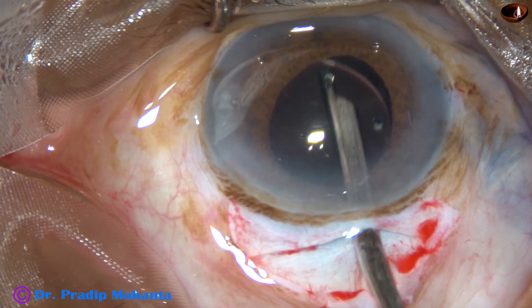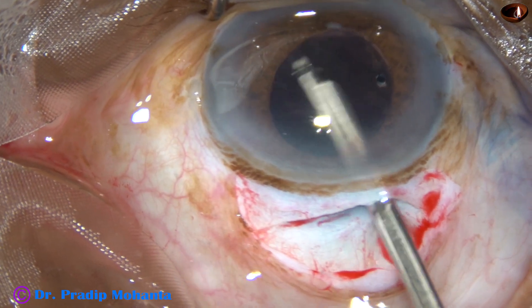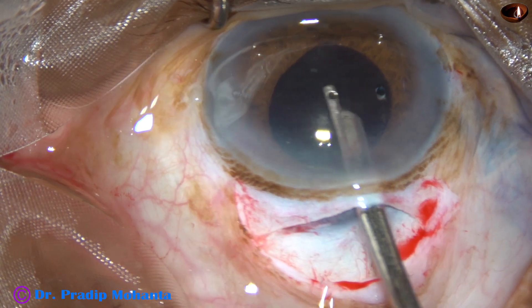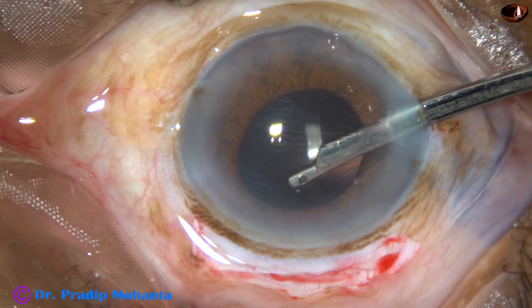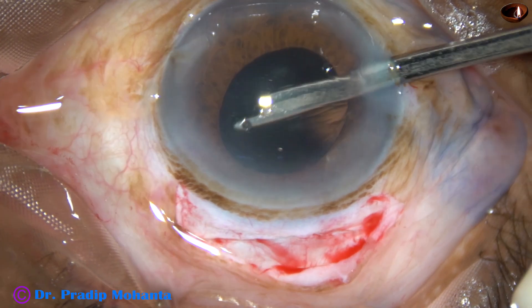At this time I am removing the visco that was used for implanting the intraocular lens. I am also removing some cortex which I can see at this moment. Some more visco is being removed from the superior part.